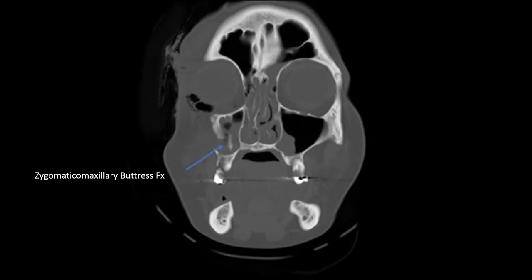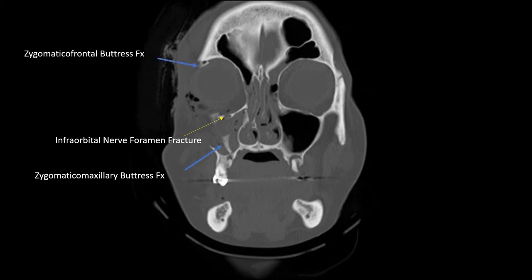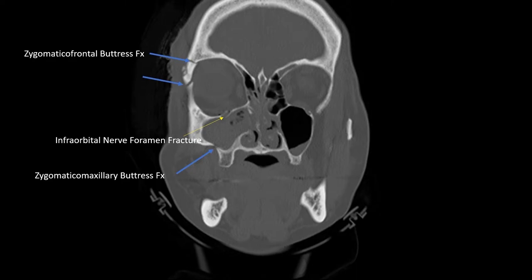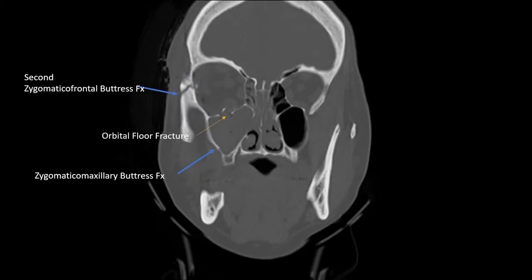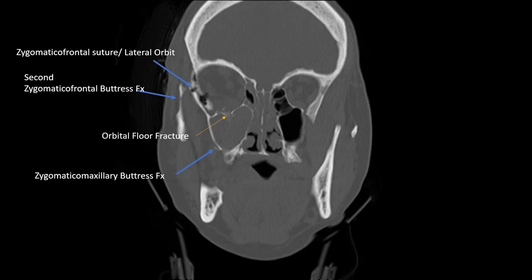You can see the lateral buttress fractures coming into view. Here you can see the zygomatic maxillary buttress fractures that have been severely comminuted and displaced into the maxillary sinus. Here is the infraorbital nerve foramen being fractured — this is a very common set of fractures in the midface. Also more superiorly along the lateral buttress involving the zygomatic frontal buttress, there is another fracture line starting up high. Here's a second fracture involving the zygomatic frontal buttress. Here's a relatively small orbital fracture located posterior to the infraorbital foramen, which is typically where the infraorbital nerve travels along the orbital floor. This likely corresponds to the zygomatic frontal suture as it enters the lateral orbital wall, but not quite at the zygomatic sphenoid suture line.